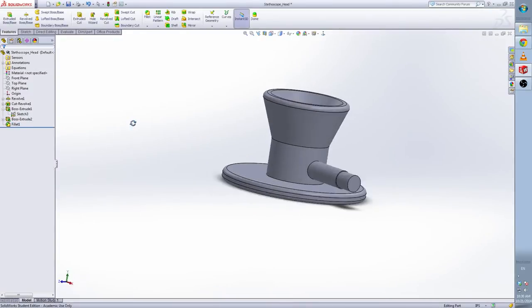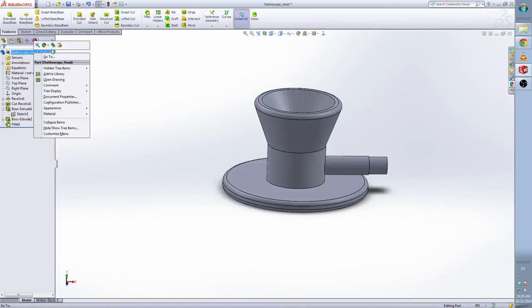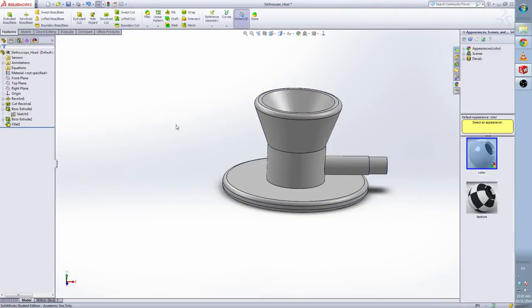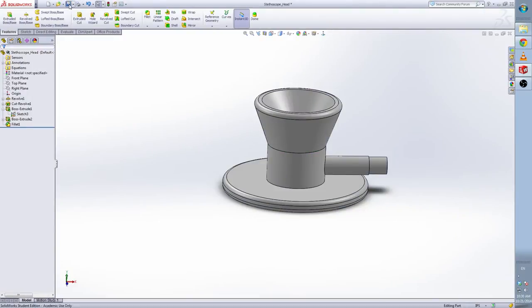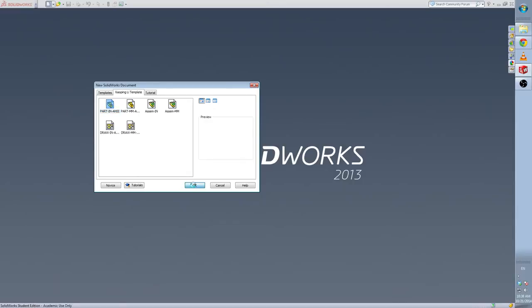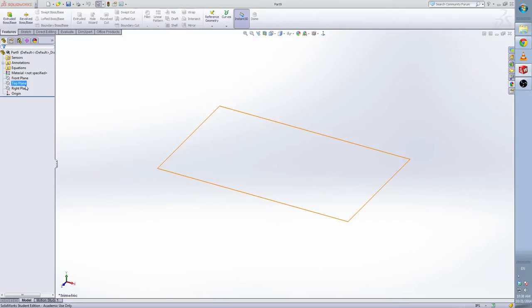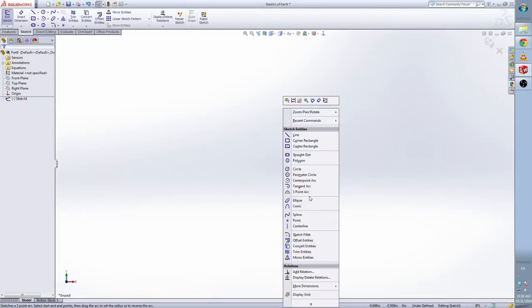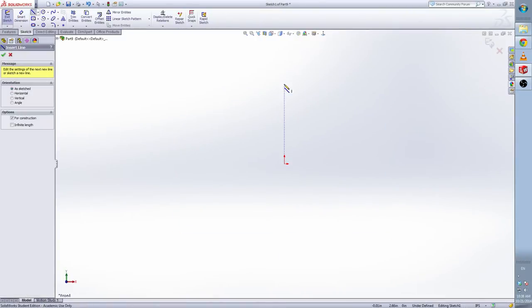Got it. Change the color to white. Save. I will make the second part — tubing. Open a new part in 5 inches. Select the front plane and make a sketch.